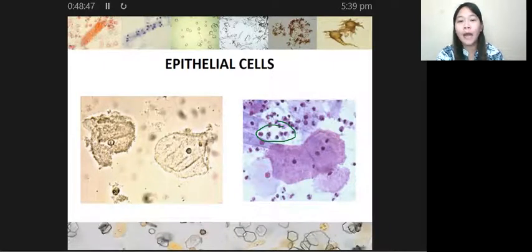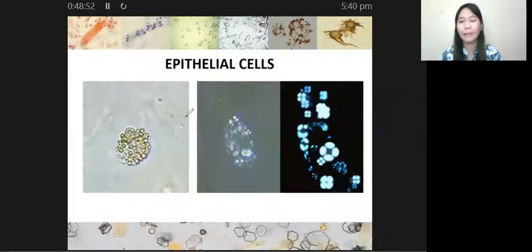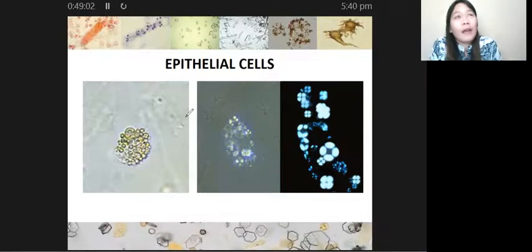All right? So another, we have here naman your oval fat bodies. Okay. At saka ganito class, share ko lang. SKL. Whenever we are given yung result ng urinalysis and then may nakita ka doon sa microscopic examination, nakita mo oval fat bodies, automatic nephrotic yan. Okay, automatic po nephrotic syndrome yan. It is a nephrotic type of renal disease.